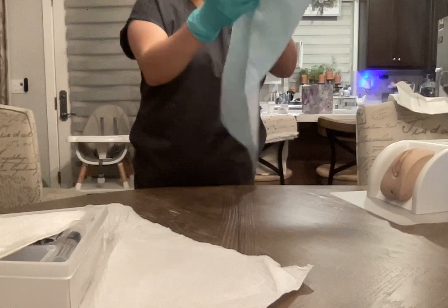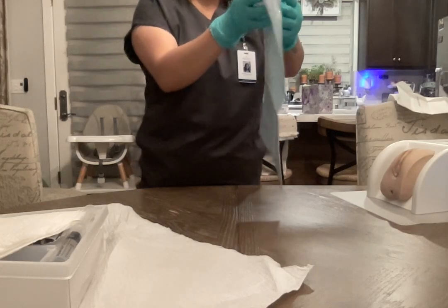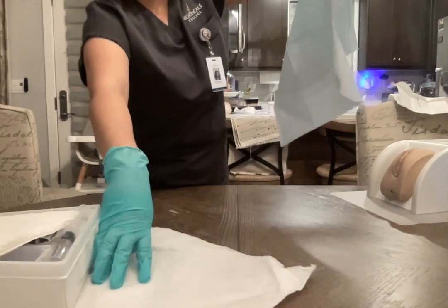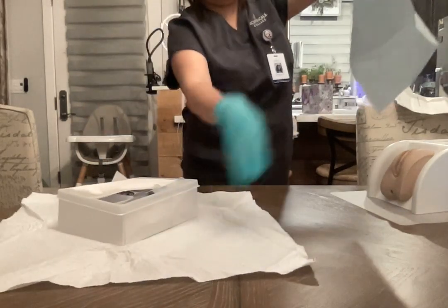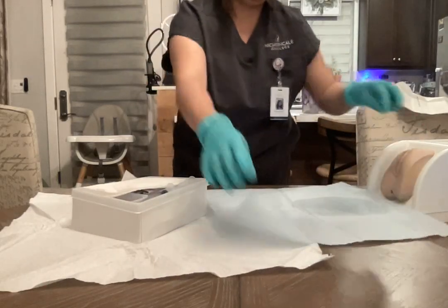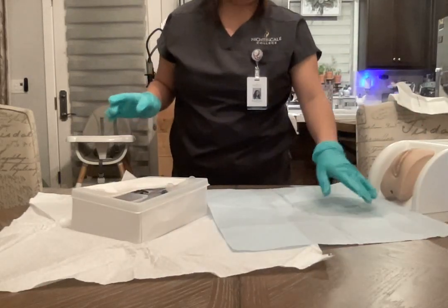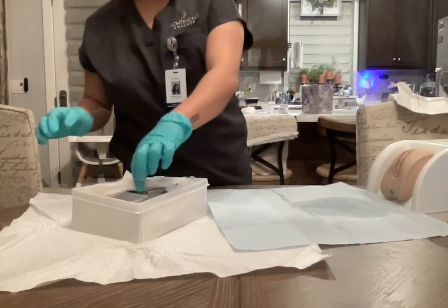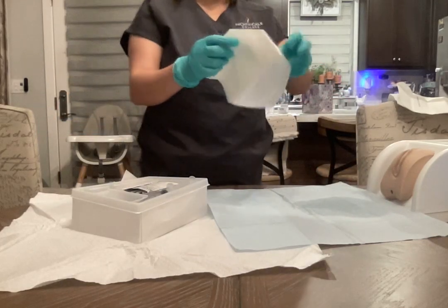Okay, will you lift your hips up and we'll put the drape under you. My drape's a little wet from earlier. Okay, we're going to put the drape over.